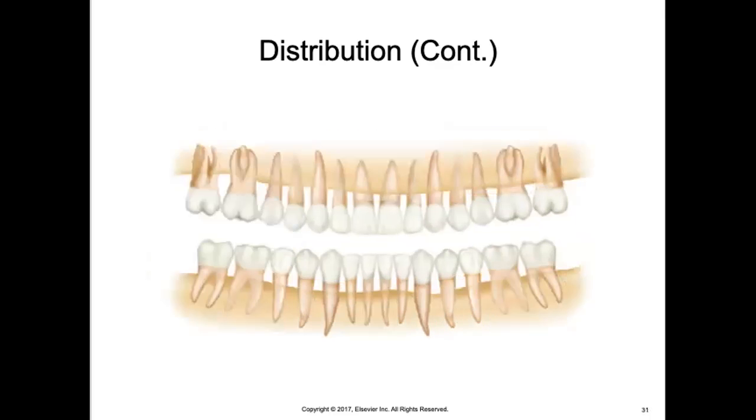Figure 34-16 shows some generalized bone loss. This patient has bone loss throughout the entire mouth. You can see that the alveolar crest is far below 2 millimeters of the CEJ. Down here on the mandibular arch, as well as the maxillary arch, we see the bone deteriorating. It's well below that physiologic bone level, or where the bone level should be.